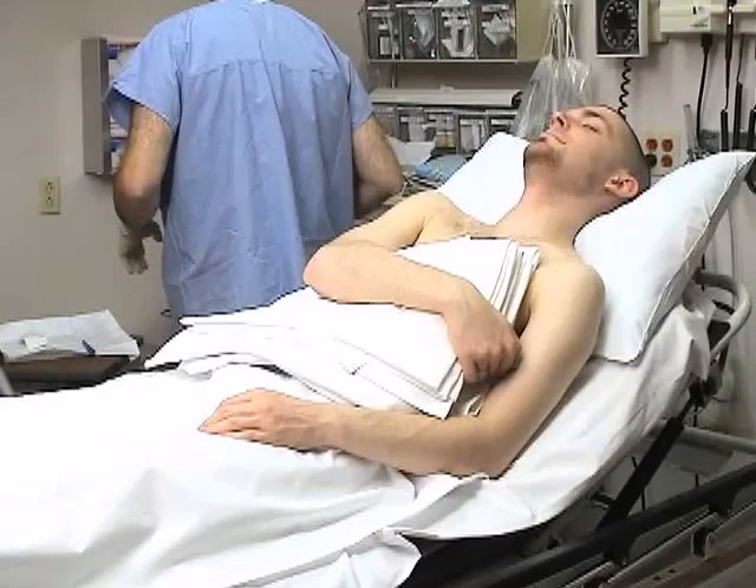Position the patient sitting on the stretcher with the elbow flexed to 90 degrees and the forearm pronated with the palm down.